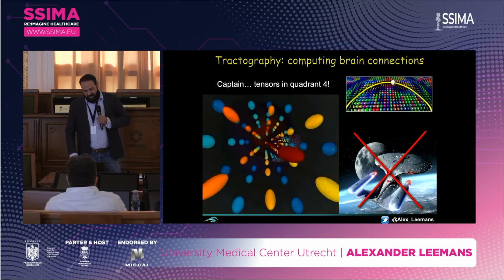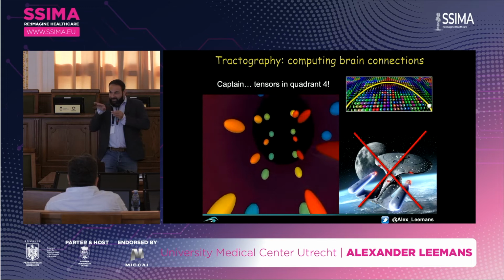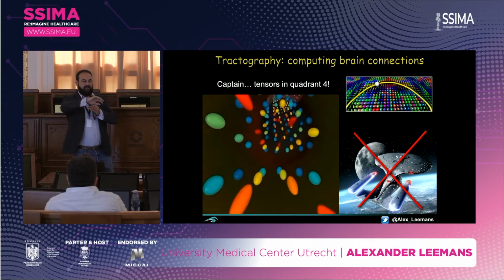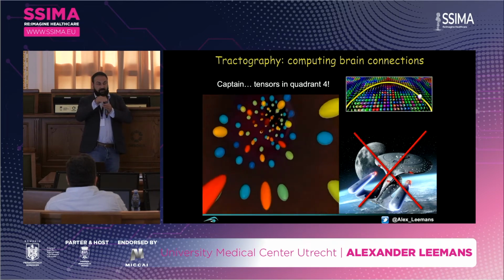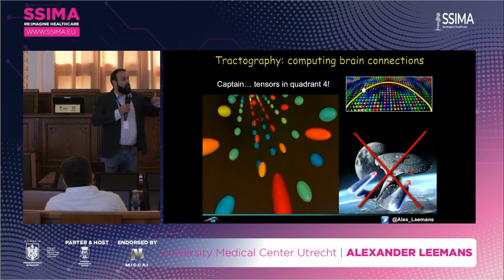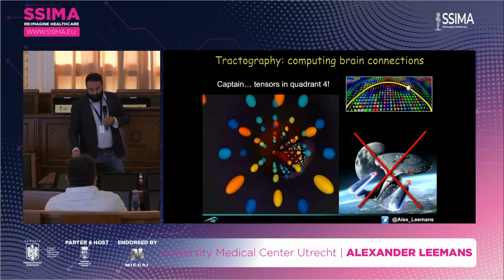But this is how a tractography starting point would look when it's traversing through this diffusion tensor space, right? And at each position in space, you would be looking, okay, what's my next position? And you follow it. Similar like in fluid dynamics, following the current, the stream of a river, right? And we do exactly the same with these data.